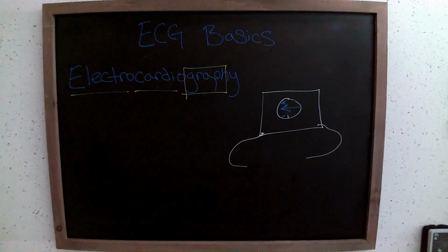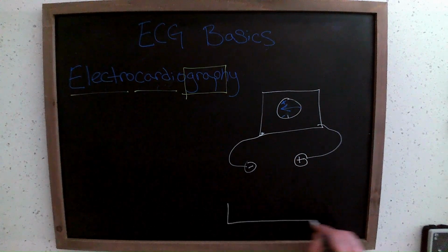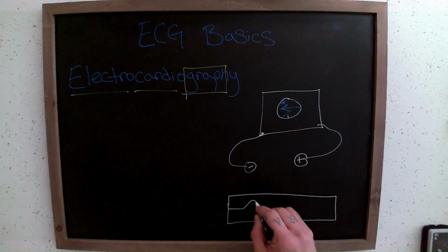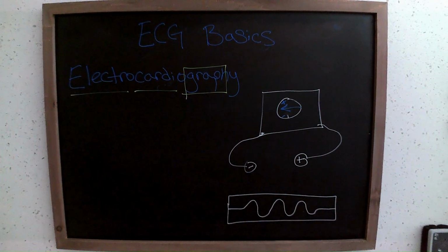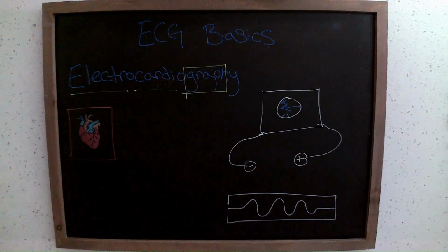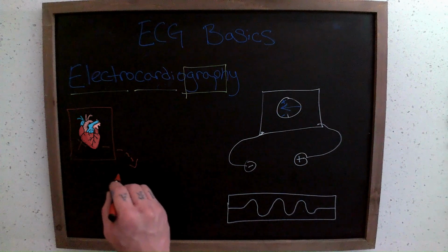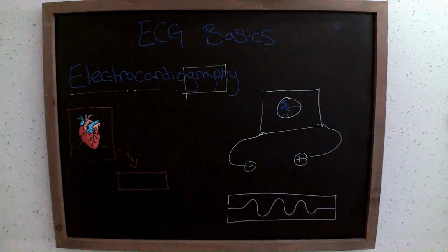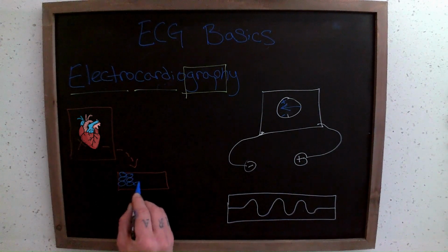So our voltmeter, or our EKG monitor, has a printer assembly and electrodes, and is going to create a graph over time representing this electricity. That's all its job is. Now let's add in our heart, because this is the battery our voltmeter is testing. Let's take a chunk out of it for a good example. This slab of meat right here, this piece of myocardium, is made up of many cells, obviously.